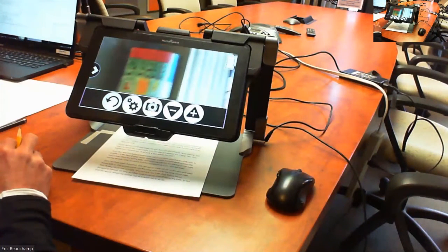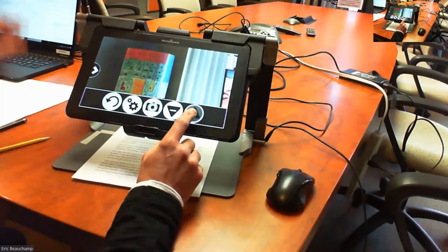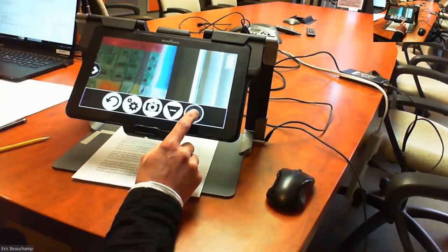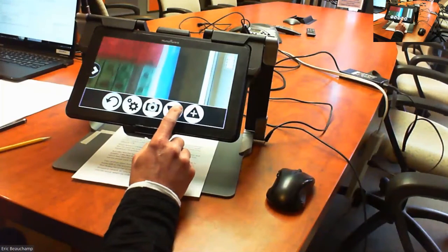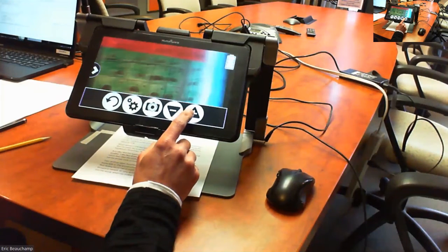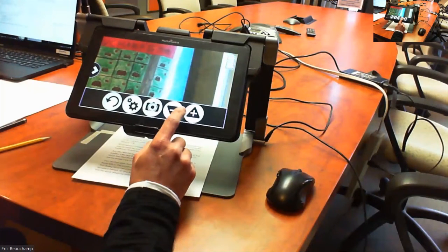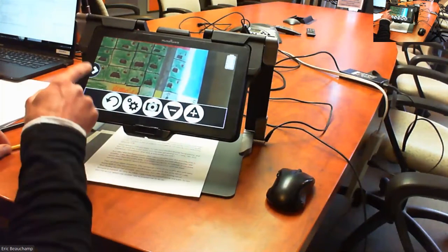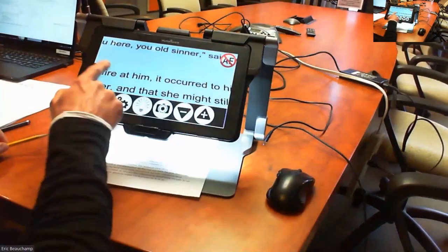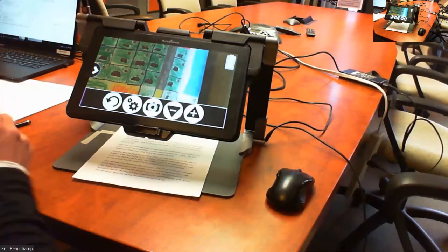Now I don't like that image with the map because I've put it on a window. But here I have an art that my son did. He's 10 years old, by the way, and he's made a kind of town. It's called the Beauchamp town. It's in French here, so I can zoom in and then move that camera around to read and see what I have on the screen. And then if I want to go back to my near, swipe left to right, very nice gesture, very quickly, and you can move around with those two gestures.